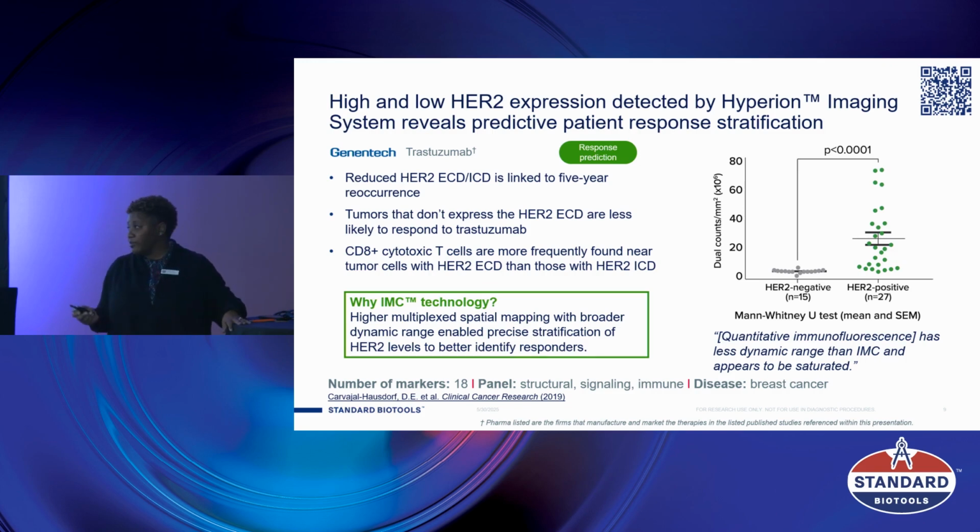And what they also were able to find with IMC, what they hadn't really noticed before, was that there was a ratio between the extracellular domain and the intracellular domain that allowed for protection as well.